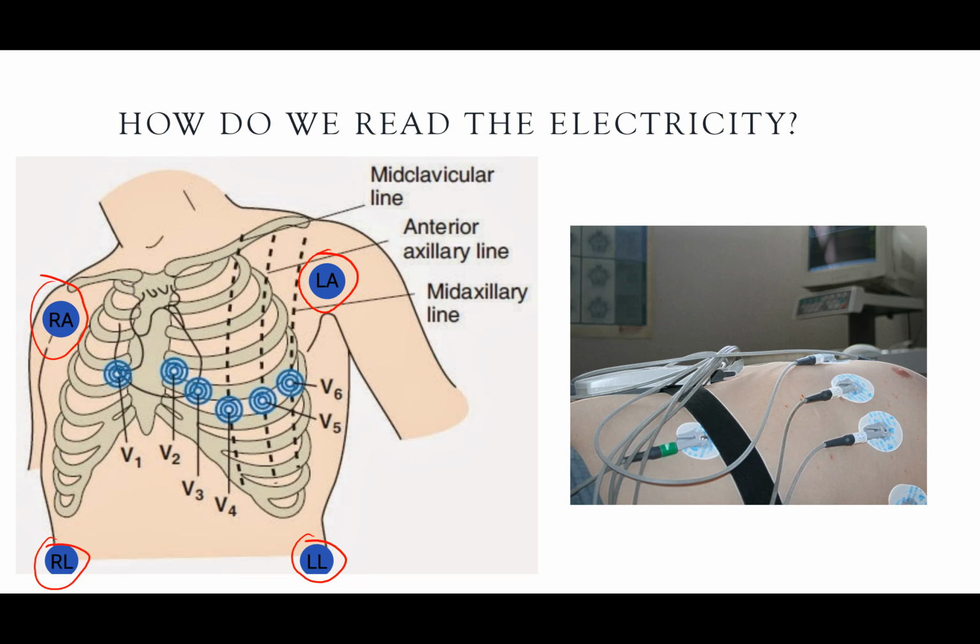Of course, we used to actually put them on the legs, and when I worked in Africa for a time, one of the ECG machines we had actually clipped onto the legs. But really, you just need to make sure that you get them below the heart. So they can be, for example, on the abdomen or around the pelvic area, as long as they're below the heart.